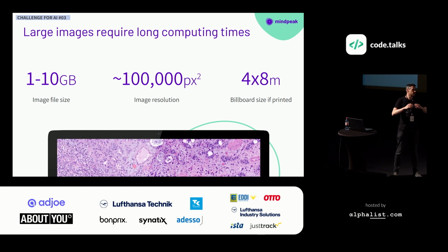Also, these images, they are humongous. If you print them out, you have a billboard that you can look at. So quite nice advertisements outside. They are sized in gigabytes, and 100,000 times 100,000 pixels are typical dimensions. So also from the computational side, it's a challenge.